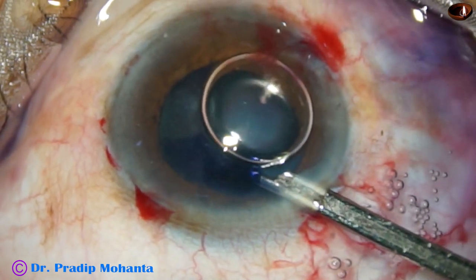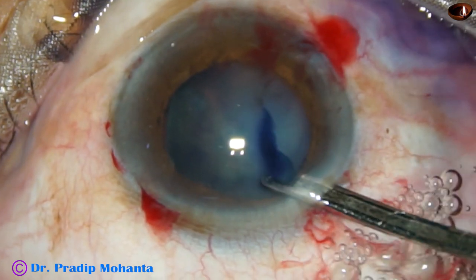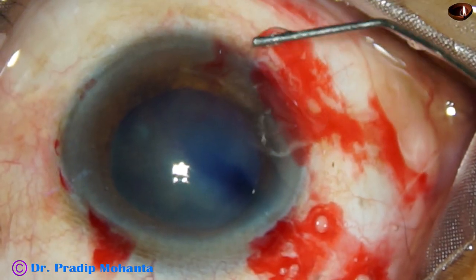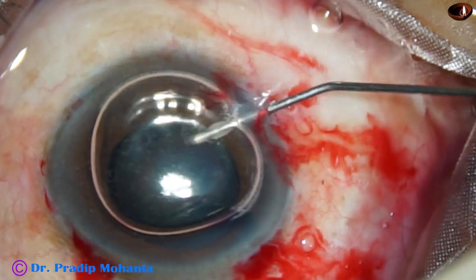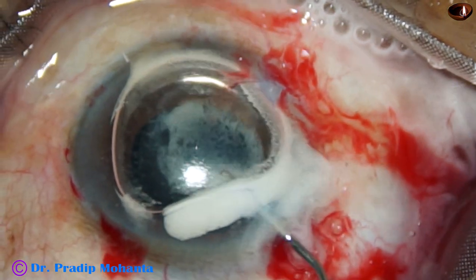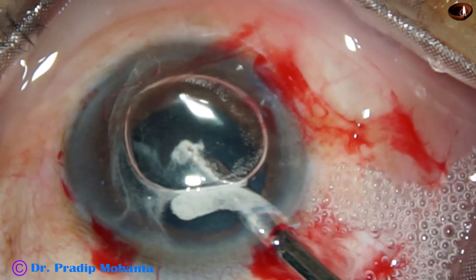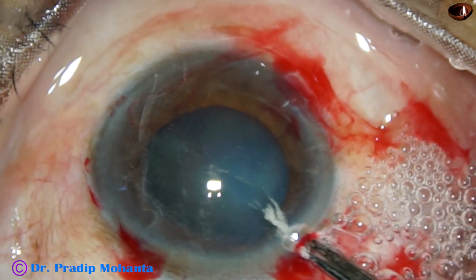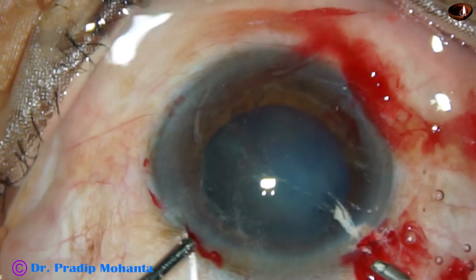As I wash the dye, I find some tags coming to the aspirating port of the Simcoe. It means there is vitreous strands. So I inject an air bubble, and inject triamcinolone to identify the vitreous strands clearly. As I try to wash, I can find a lot of vitreous strands. So I ask for a vitreous cutter.